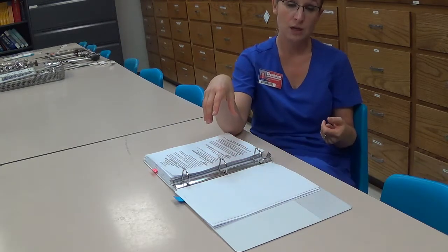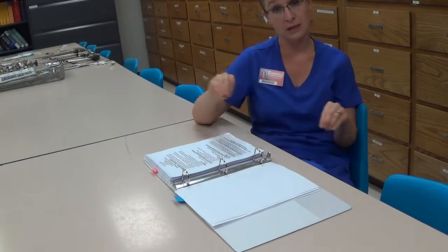And then you'll want to have some cords prepared for a laparoscopic case, and if at all possible for an arthroscopic case too. So you'll want to talk to the students about how we toss off cords for such cases as a lap chole or a lap hernia, making sure that they're positioned for use, handed off in the order in which they're going to be utilized, starting with the insufflation tubing, positioned so that they go off to the video tower, but positioned where they will be used up at the field, and then tucked in the pouch of a lap chole or a laparoscopic sheet.